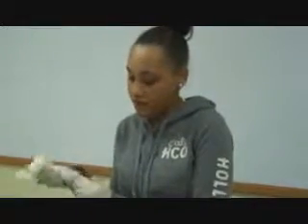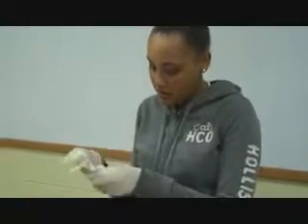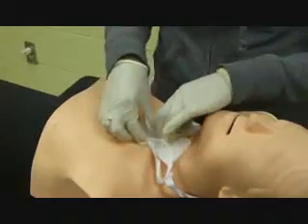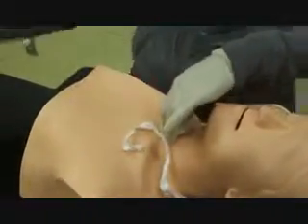First, I'll be putting my gloves on, my non-sterile gloves. And some patients, actually most patients, will most likely need suctioning before tracheostomy care. So when you do suction, you would use aseptic technique. I now have my gloves on. We're going to start off by removing this nasty, dirty gauze and discarding it.